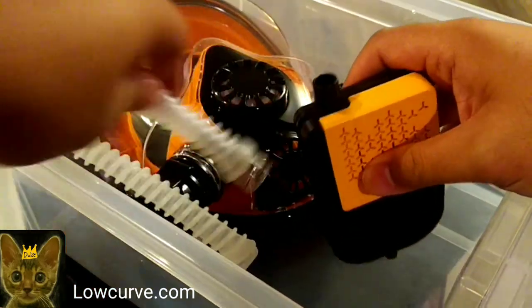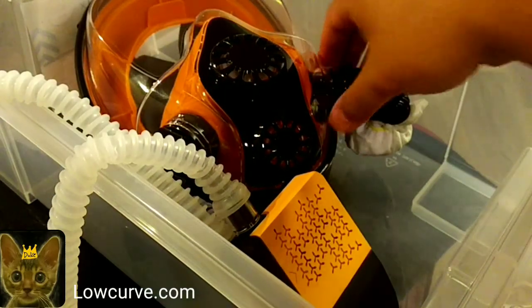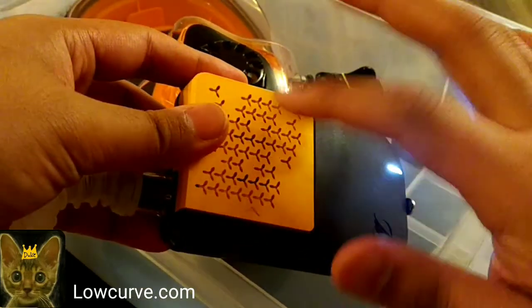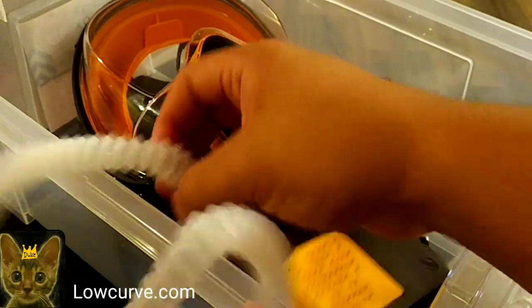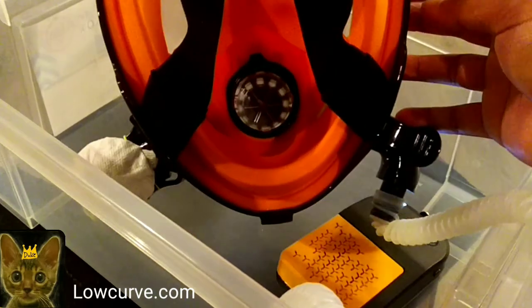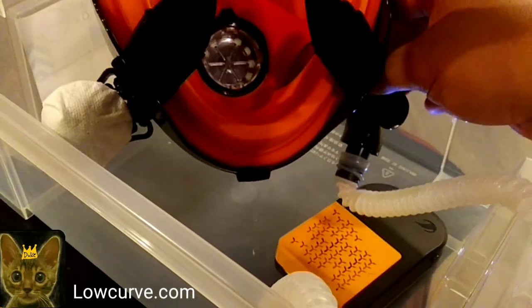This is meant to give a sort of PAPR type functionality. So air enters, or this, let me see, where's the button here? It's been a while. Air is pulled by battery through this, which has a built-in little HEPA filter there. Then it goes through this long, rubbery tubing into this input in the mask, and the other input is covered with our familiar Infinite N95 setup.